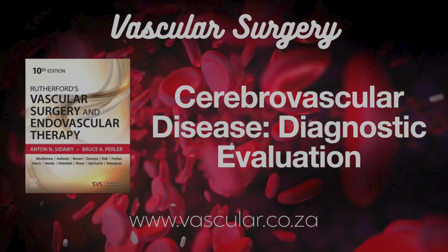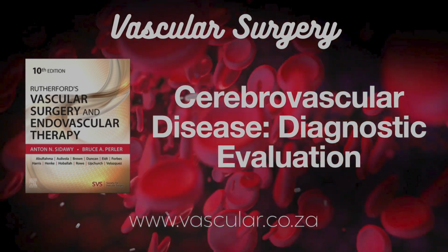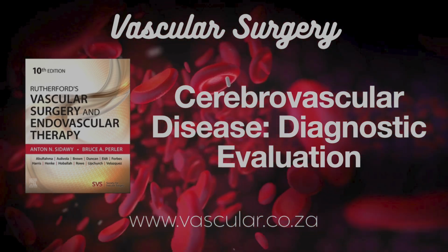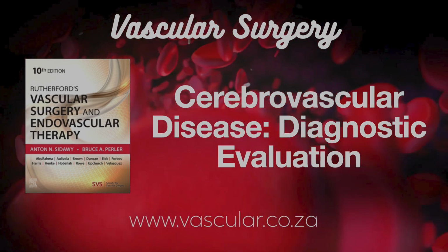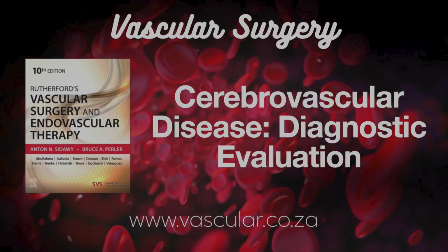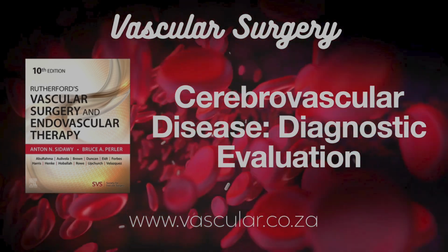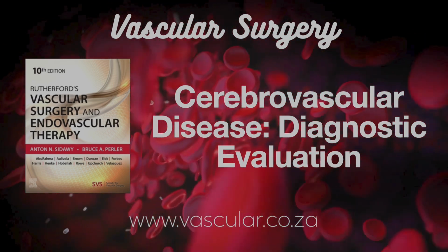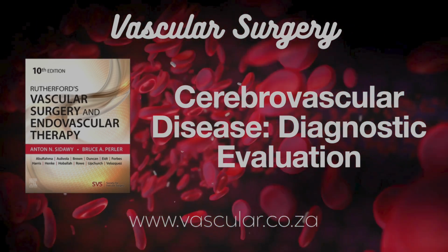Yeah. Okay, let's turn to something different. Transcranial Doppler, TCD. Sounds like it's looking inside the head. It is. TCD is another ultrasound technique, but it uses lower frequencies that can penetrate the skull bone at certain windows, usually around the temples or the back of the head. It lets us look at blood flow in the major arteries at the base of the brain, the middle cerebral, anterior cerebral, posterior cerebral arteries. So monitoring flow inside the brain itself in real time.